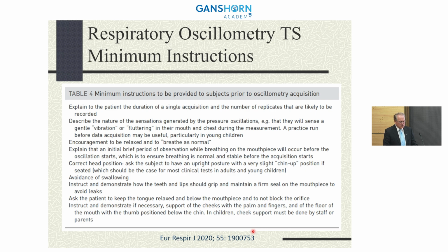In the technical standard, they have minimal instructions that need to be given to the subject themselves. Those minimal instructions include not only how to put the mouthpiece in correctly, of course, biting down on the mouthpiece gently, just like in spirometry, making sure the mouthpiece is on the top of the tongue versus the tongue having an influence, making sure that they have a nose clip and a tight seal.